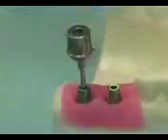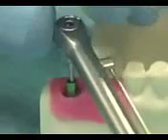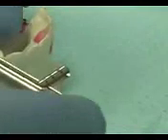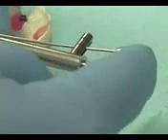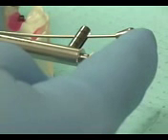So here we place the solid abutment on, that's our wide neck solid abutment, and here again we take our torque driver. The torque driver fits on this just like it did the other. We now go ahead and start torquing this until, when we look at our torque wrench, we have 35 Newton centimeters of torque, so that we know this is then torqued to manufacturer's specifications.